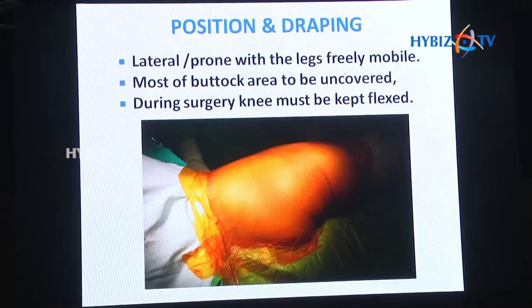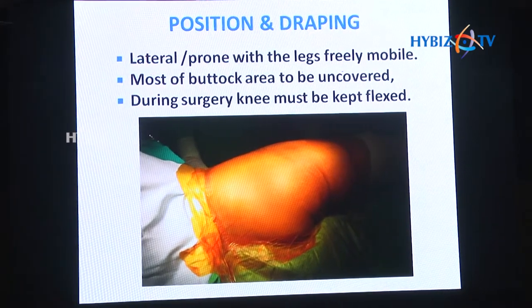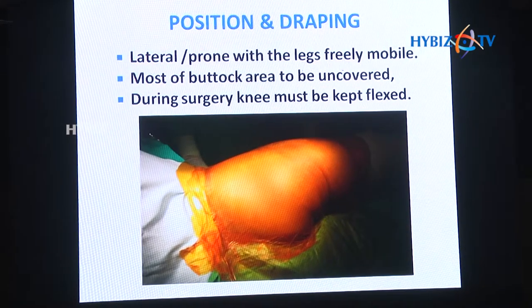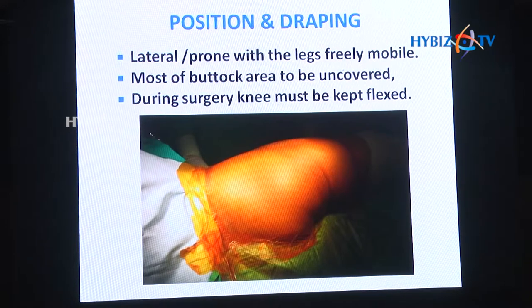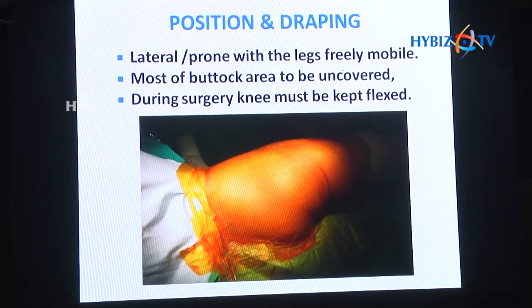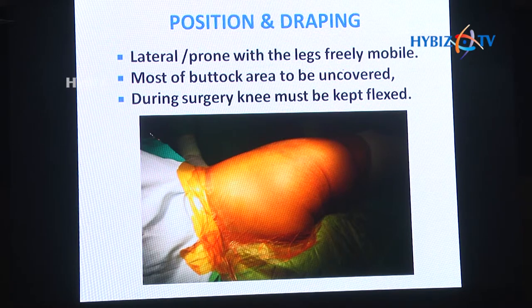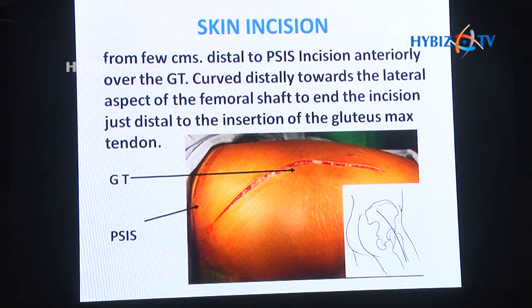With legs freely mobile, most of the buttock area has to be uncovered. During surgery, the knee must be kept in flexion and the hip in extension so that you don't stretch the sciatic nerve.